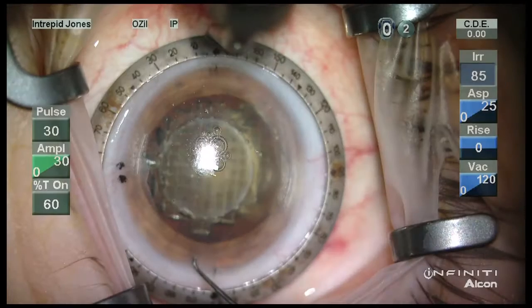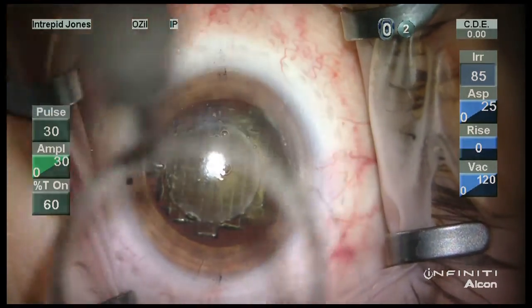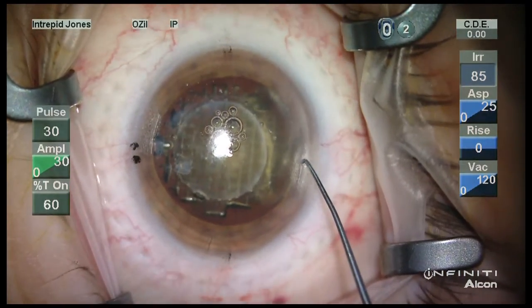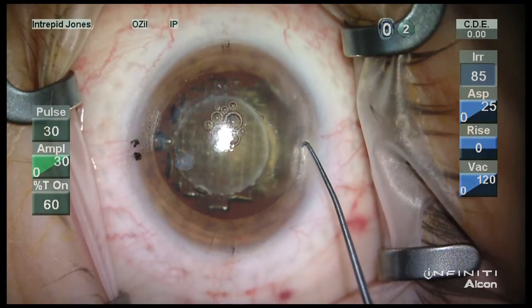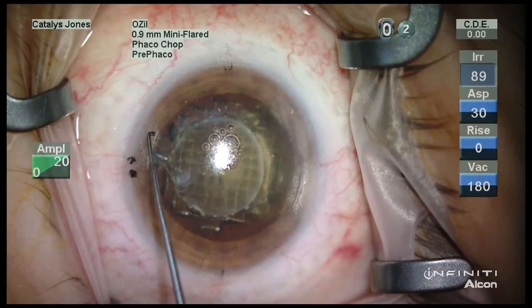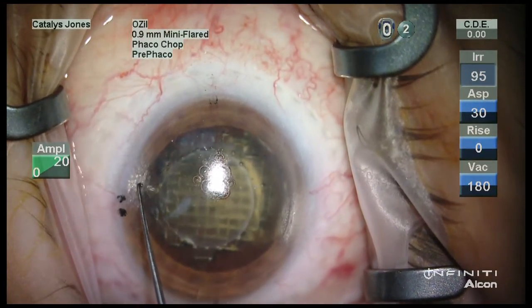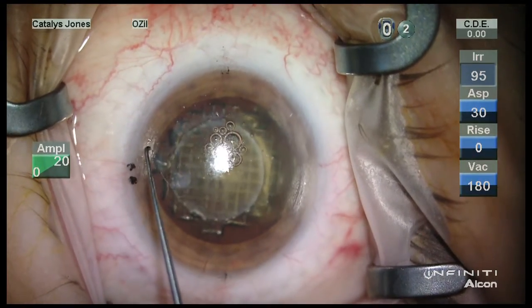You can see here the breakthrough with the bubble formation into the saline filled cup of the liquid optics interface. Also, note here that these marks are fairly durable, and they permit orientation of my keratome incision in this case.